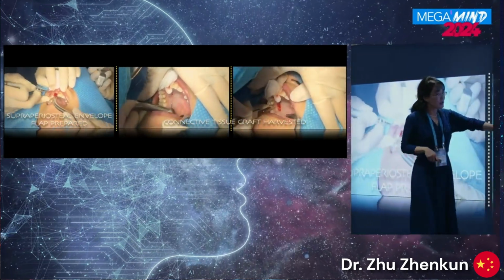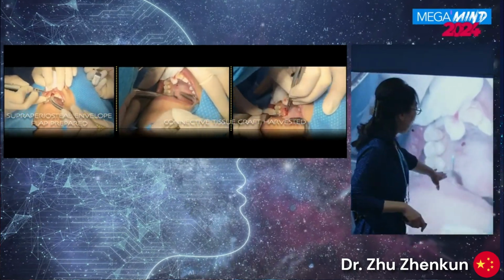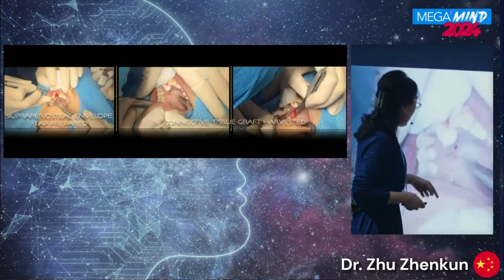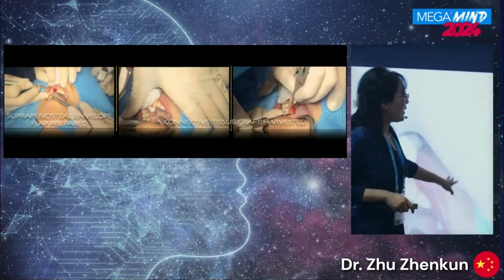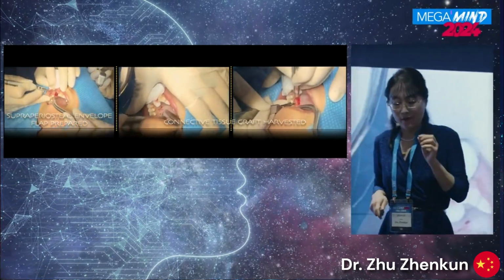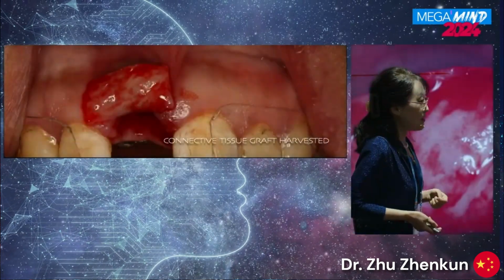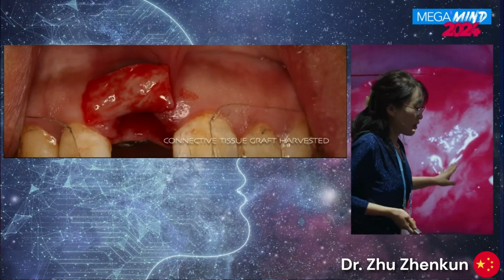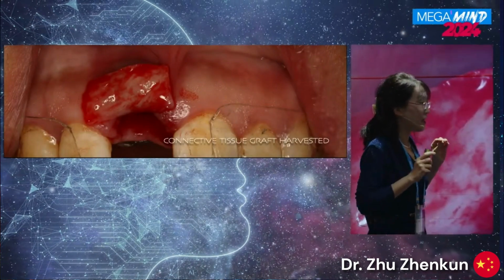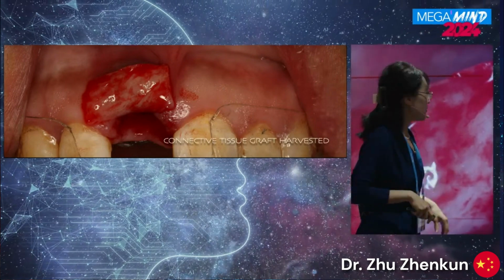The first step is that we de-epithelialize by using a high speed rotating bur, and then we trace the graft with the tip of the blade. Why do we use this method? That's because this method can guarantee we get a free CTG with a very dense connective tissue layer.